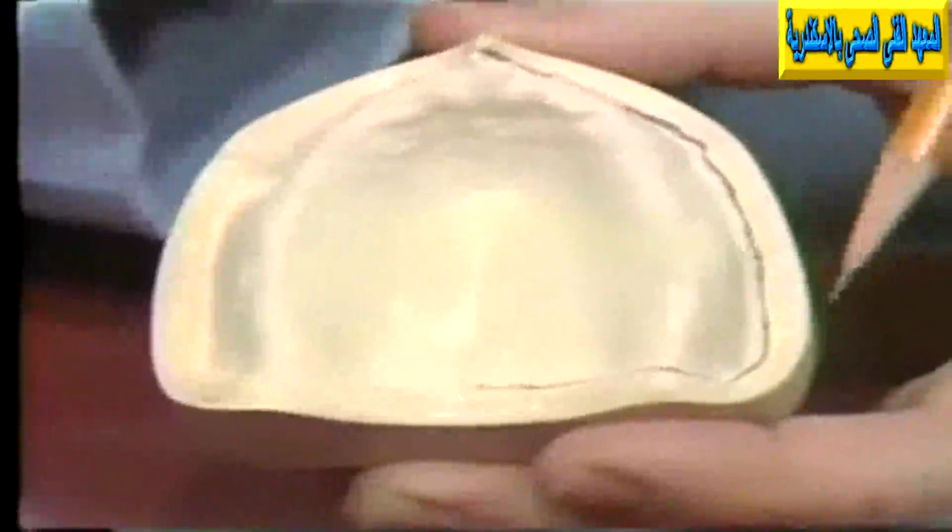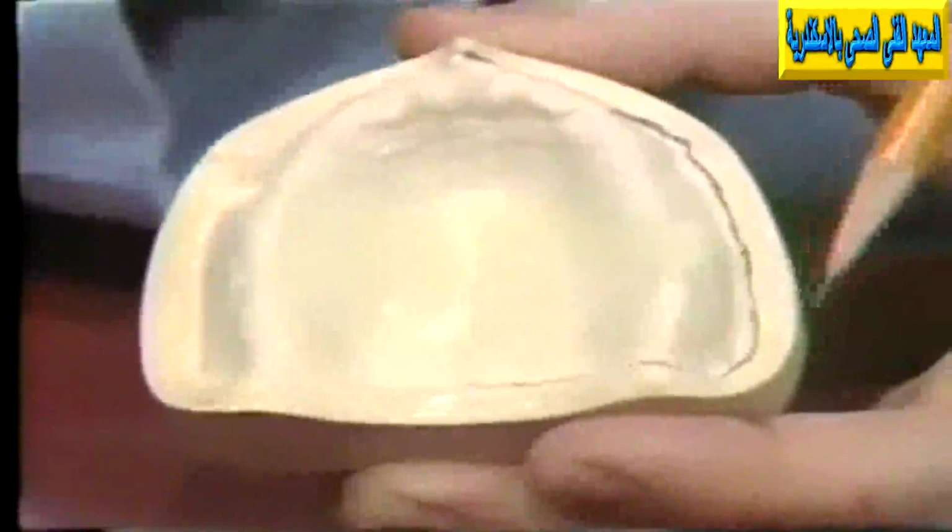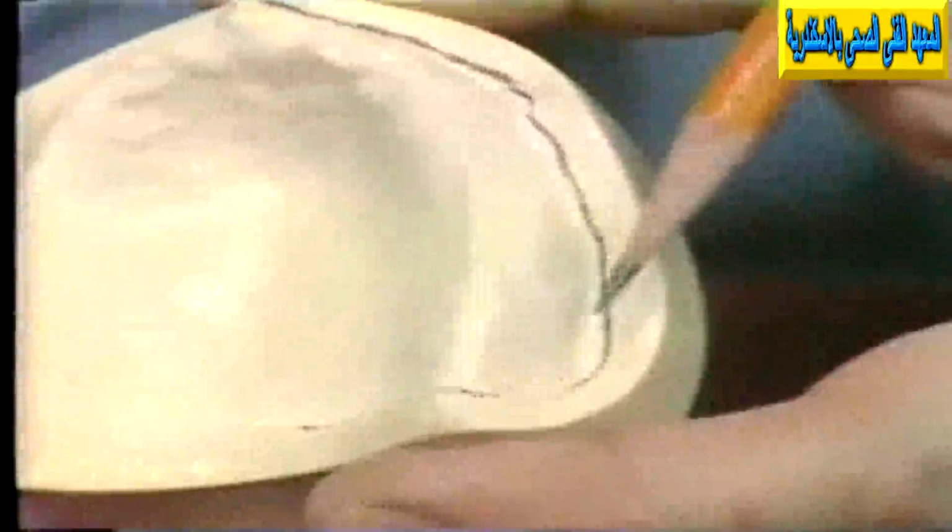It's very important not to over-trim a master cast, because if we, for instance, over-trimmed in this area into, say, an area such as this, we would actually be encroaching upon tissue surfaces, and there's no possible way of completing the denture and having the denture fit over that portion of the mouth.